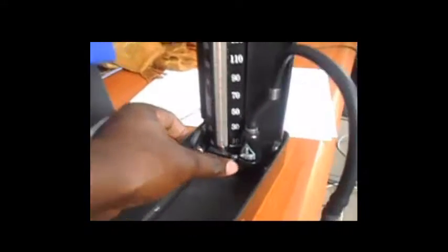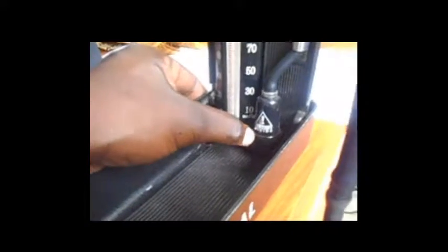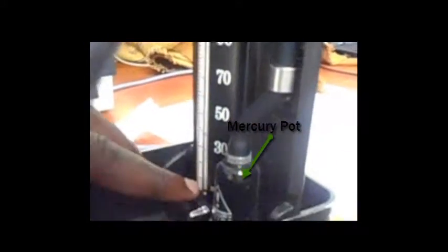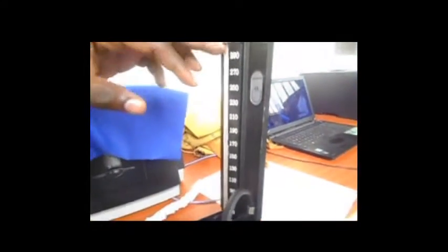We also have the on and off button. Before you start inflating your cuff, you put it on. After using, you gently push it off. Here is the mercury port — that is where the mercury is going to come out and rise in the tube.